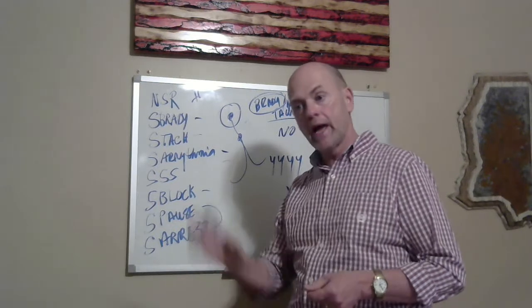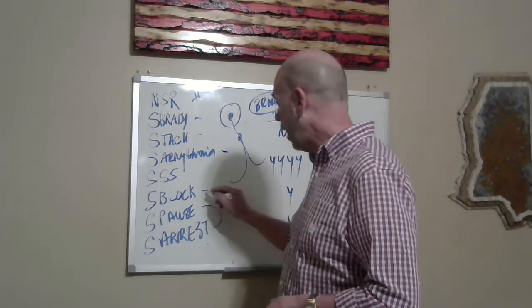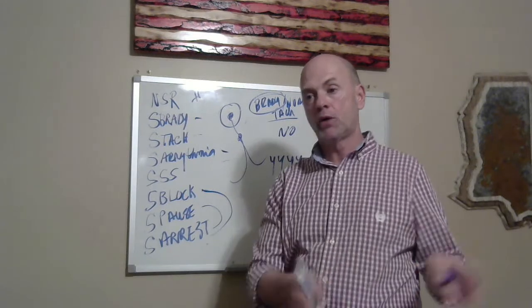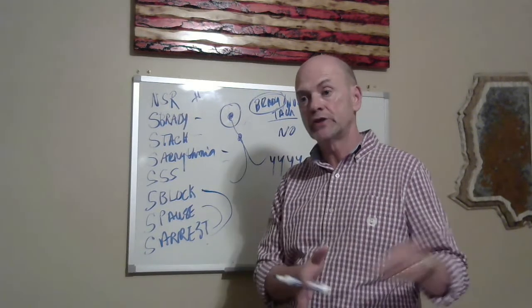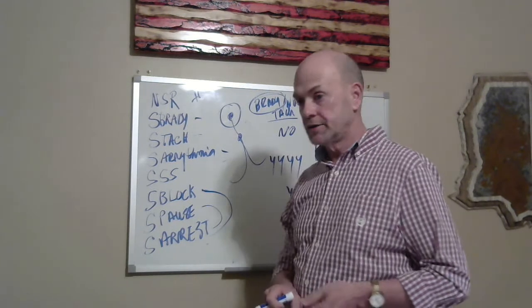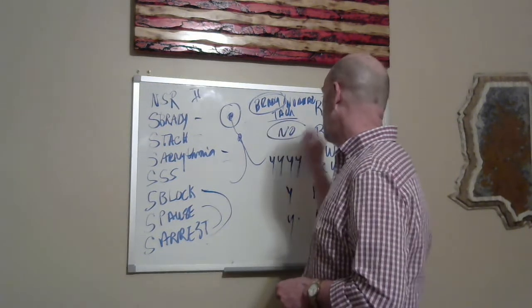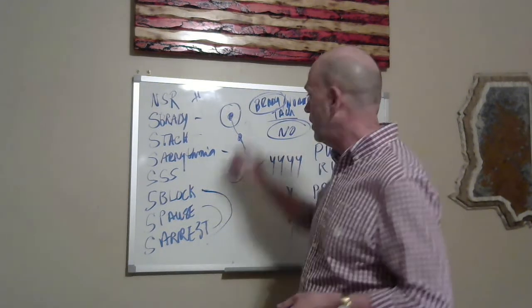Pause likely only has one missed beat. Arrest may have more than one. Block likely has more than one, but could only have one. Block walks out. Pause and arrest do not. Pause versus arrest: pause is usually a shorter spaced time before the next beat occurs. So again, they can be bradycardic, tachycardic, or normal cardiac. They are not regular because we have spaces where we don't have any activity generated from that SA node.